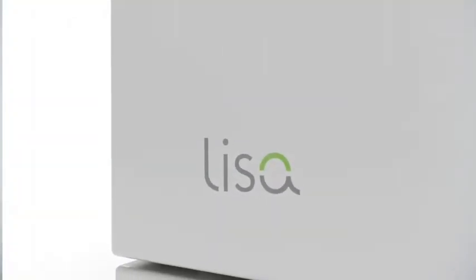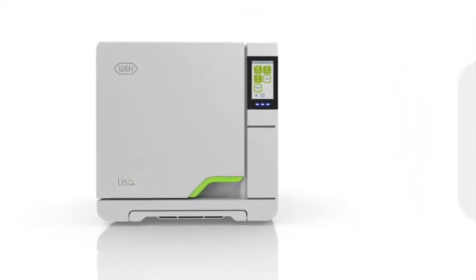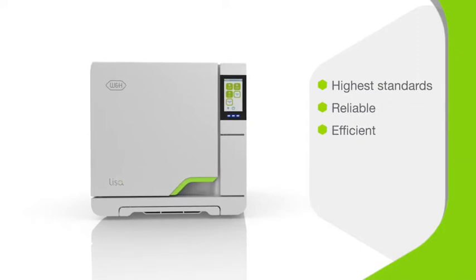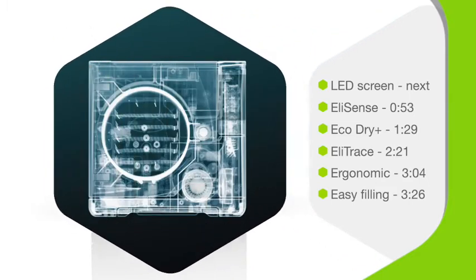Introducing the Lisa VA-131 Vacuum Sterilizer. This Type B sterilizer from W&H processes to the highest standards of safety and hygiene in modern dental practice — reliably, efficiently, and faster than ever. Keep watching to discover how the Lisa is incredible, inside and out.